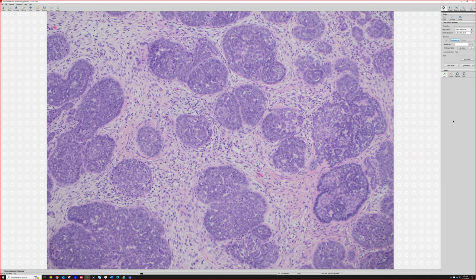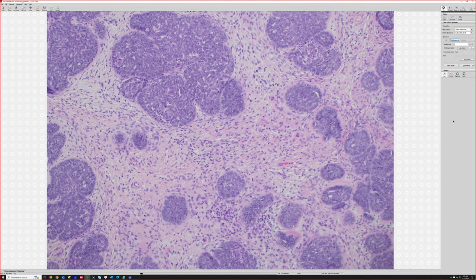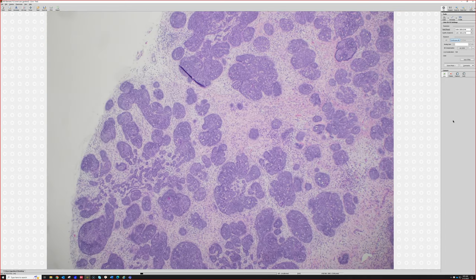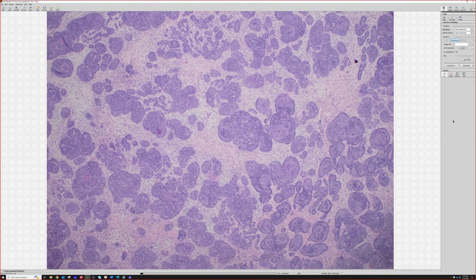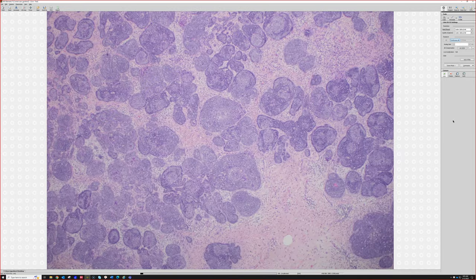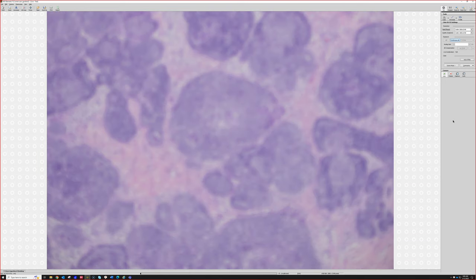Papillary mesenchymal bodies. Those tend to be more abundant in the smaller superficial trichoepitheliomas. And I feel like it's hit or miss whether you see them in trichoblastomas. If you find them, awesome. But I don't recall this one having any real good papillary mesenchymal bodies. So I am not disturbed by a trichoblastoma without good papillary mesenchymal bodies, because that's okay.